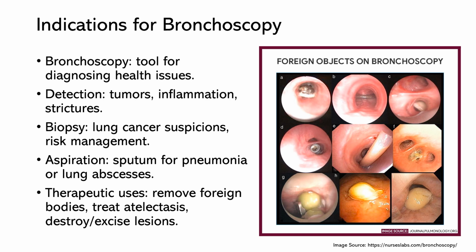Now, bronchoscopy isn't just a sightseeing tour of the respiratory system. It's going to help us investigate and tackle lots of different health challenges our patients might be facing. Let's say we have a patient who's had a persistent cough for a couple weeks and some abnormalities on their chest x-ray. A bronchoscopy can help you peer inside their respiratory tract. You might discover a tumor, inflammation, strictures, or a foreign object. Suddenly, you're not just treating symptoms, you're looking at the root cause.